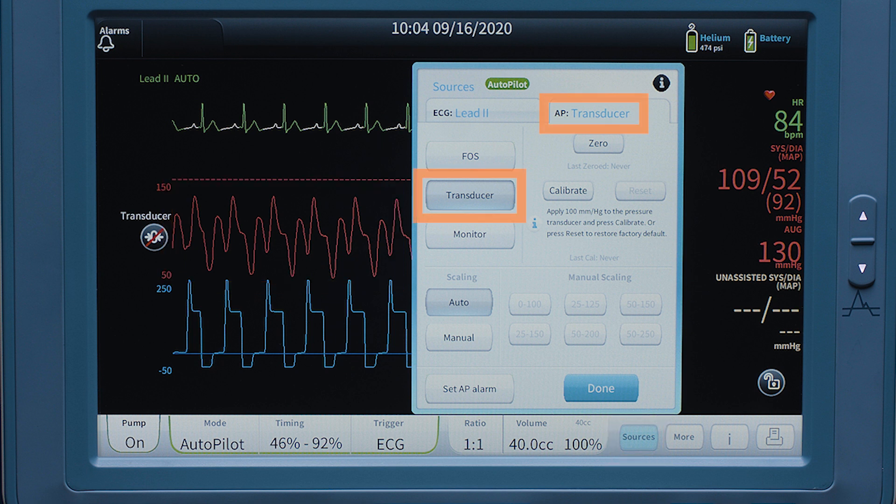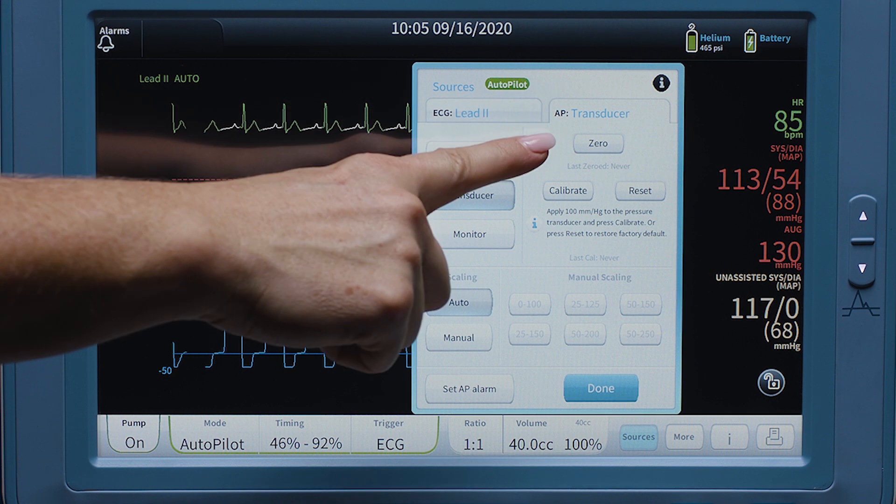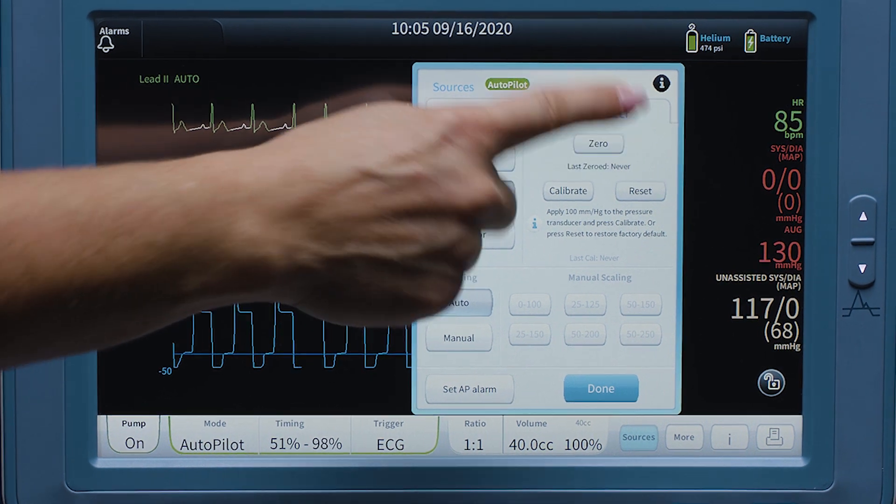Ensure that the AP sources tab shows transducer as the source. Open the transducer to air, press the zero key, then close the transducer to air.